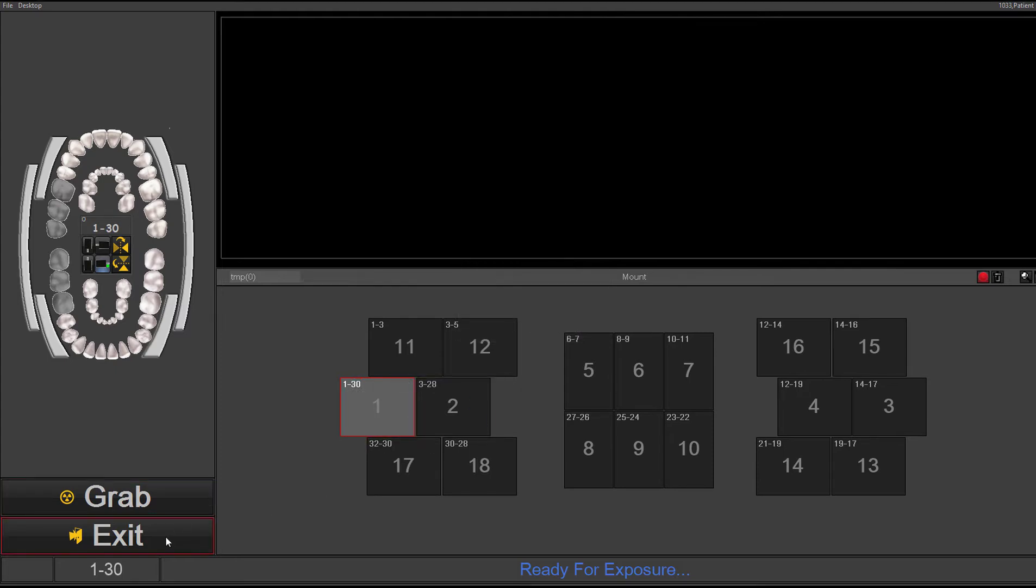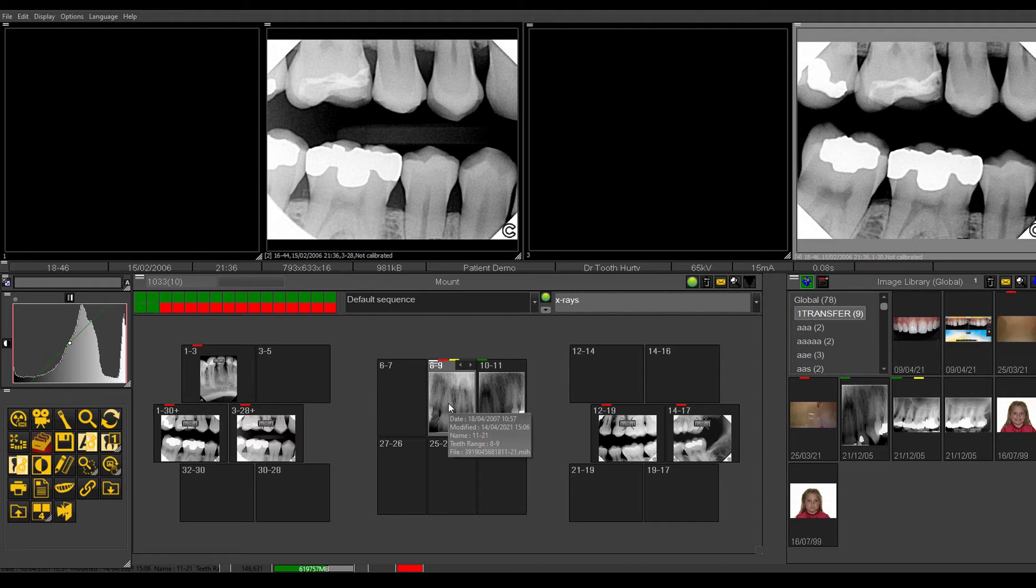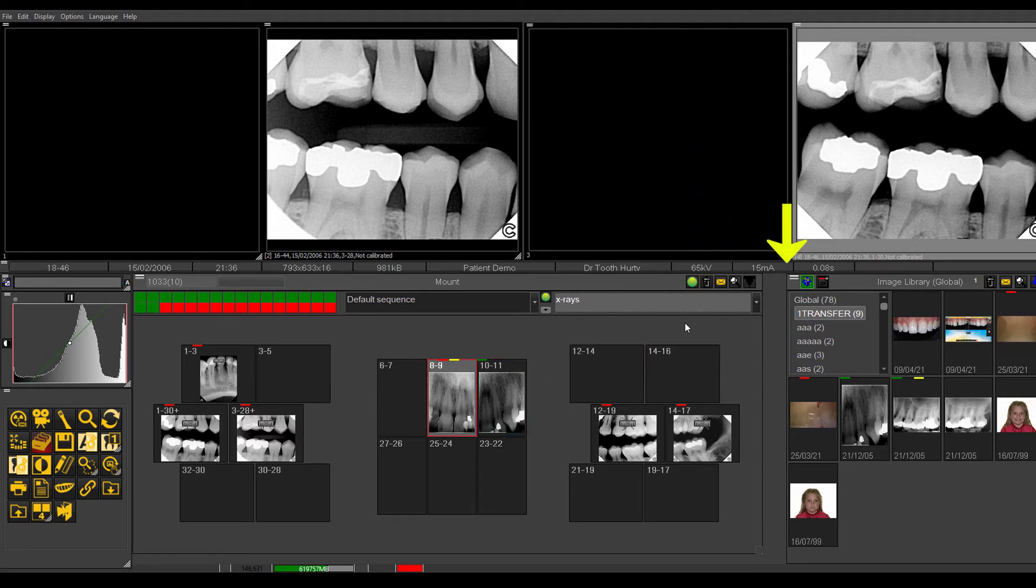Okay. So whenever you see anything here that you want to delete, you can easily click, drag and drop. And then you can delete those images.